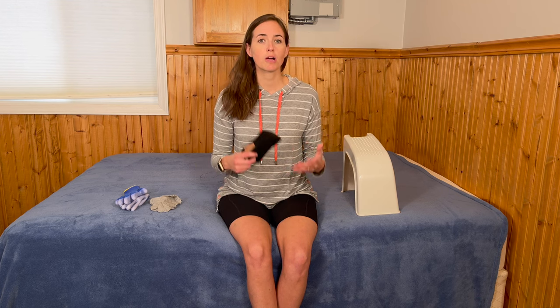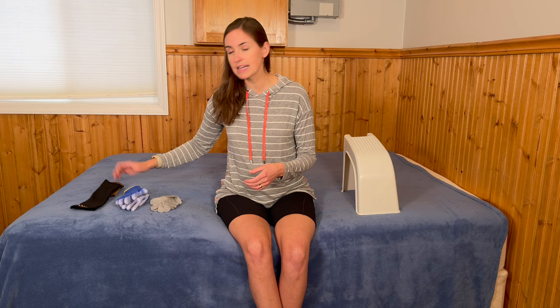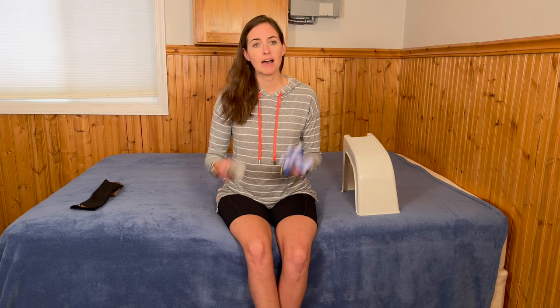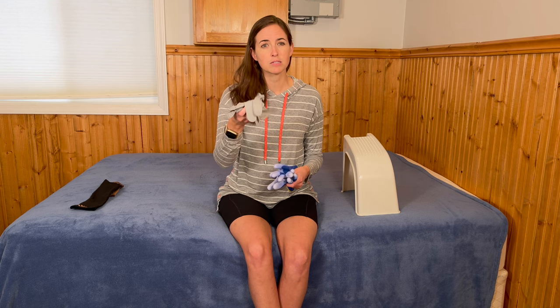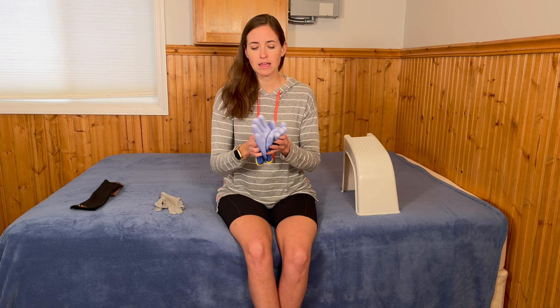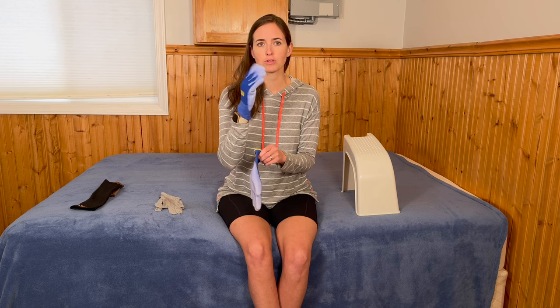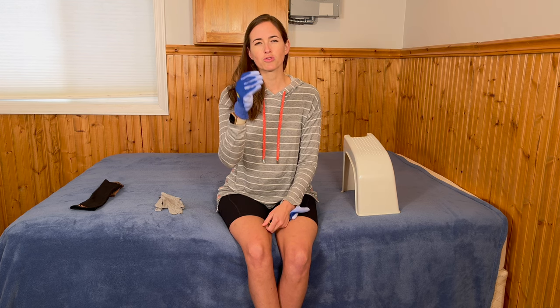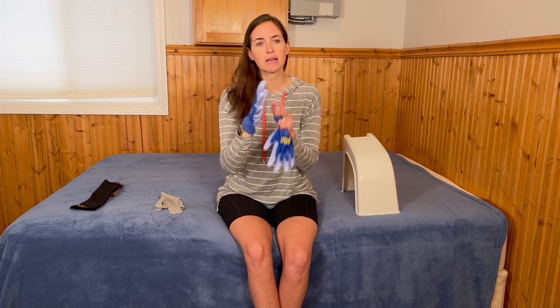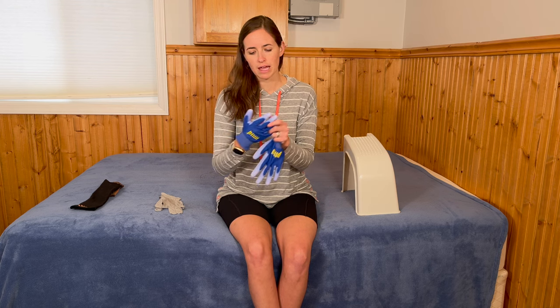I'm going to talk about a few things I didn't mention in my first video that can be super helpful when dealing with compression stockings, which can be notoriously difficult to manage. One thing I strongly encourage is having some sort of rubber glove — whether that's a reusable or disposable option like those found in hospital or clinical settings, or reusable rubberized gloves from the hardware store. They have a rubber coating on the palm to make it much easier to grip those slippery nylon-style compression garments, helping you get all the wrinkles out as you pull them up your leg.